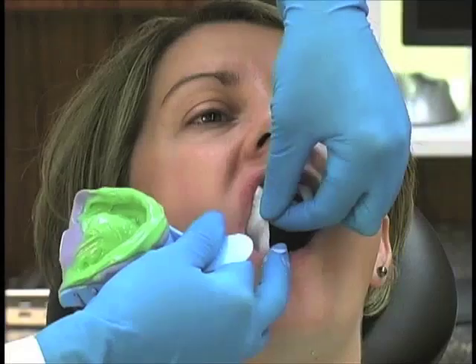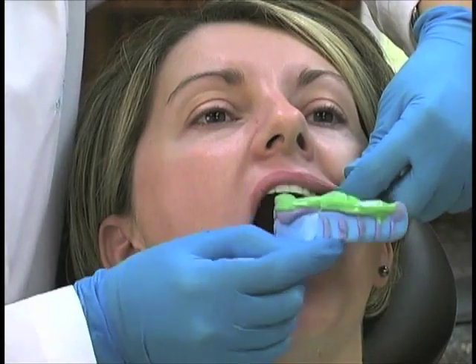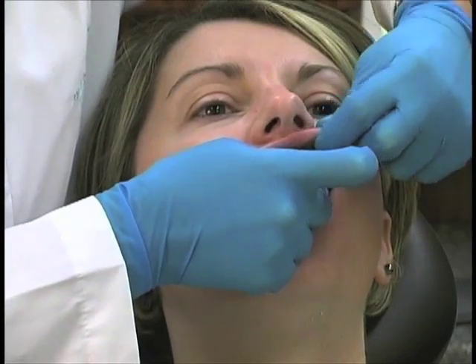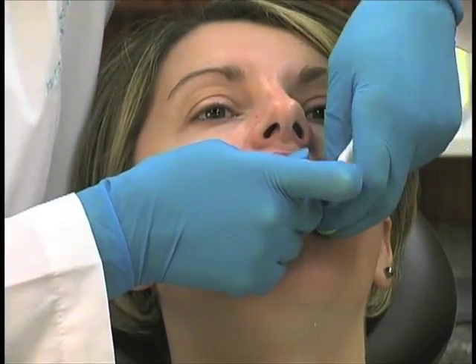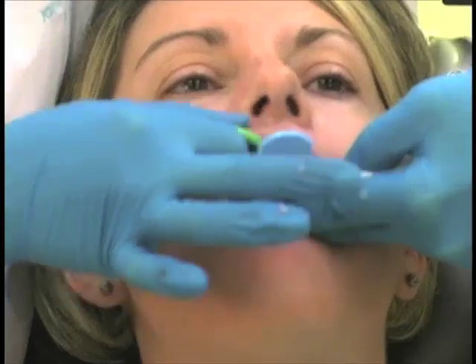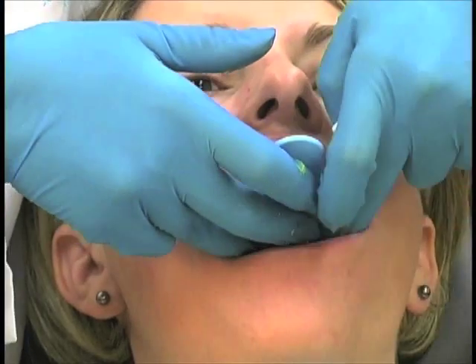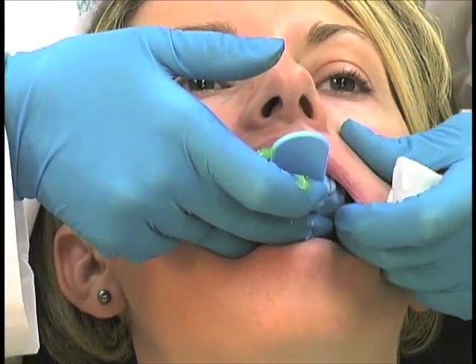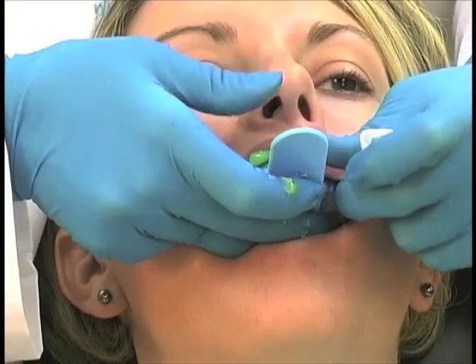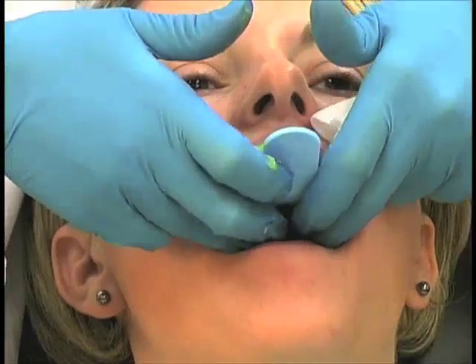Pull the cotton out. And then we're going to go ahead and seat this tray. And lift that lip up. Again, border molding, pushing that material. You get unbelievable extension.